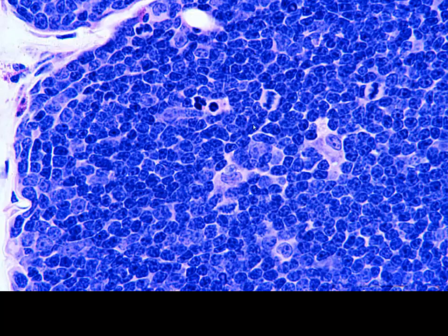But the other thing that I want to point out, you see these really dark nuclei. I mean, we're almost talking about orthochromatophilic here. These really dark, small, black nuclei, these are called pyknotic nuclei. And pyknotic nuclei are indicative of dead and dying cells.